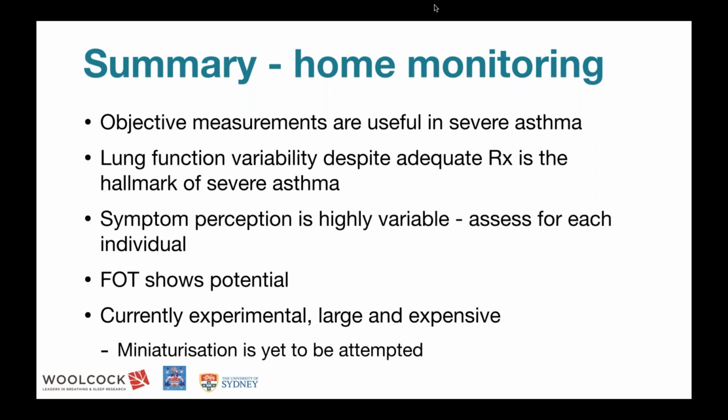Lung function variability despite adequate treatment is a hallmark of severe asthma. And symptom perception, be wary of it, because it varies greatly between individuals and we can get ourselves into a lot of trouble if we don't appreciate that variability. The FOT is I think one of many different ways of monitoring people that I think will change and improve the way that we do things.